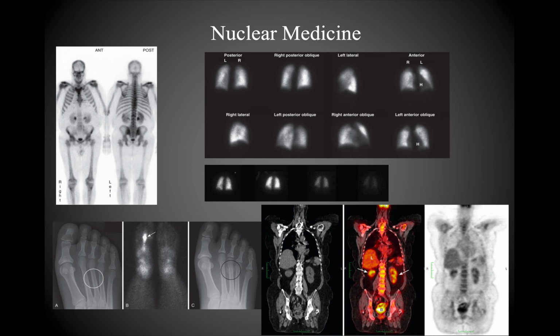And then below that, you can see this is another radiotracer that was injected to assess the circulation, the pulmonary circulation. So again, you can see where there's quite a bit of utility in nuclear medicine in terms of what we can assess.